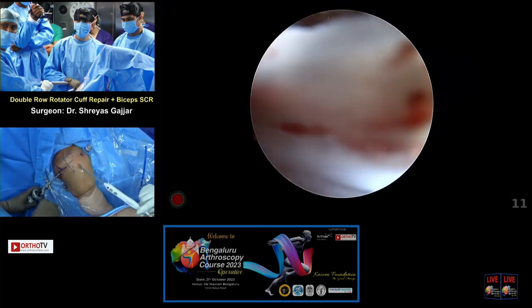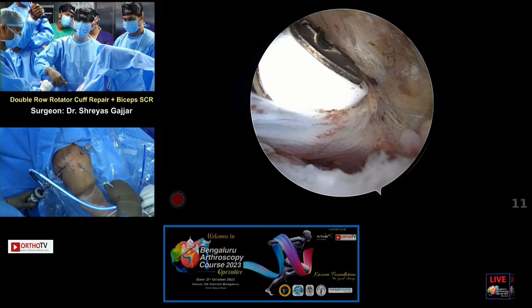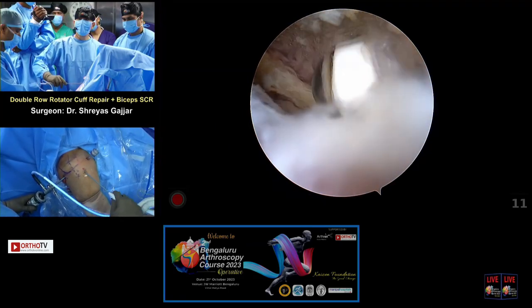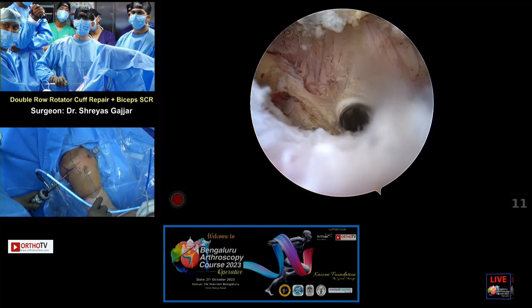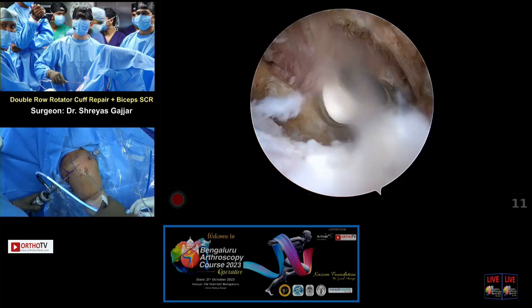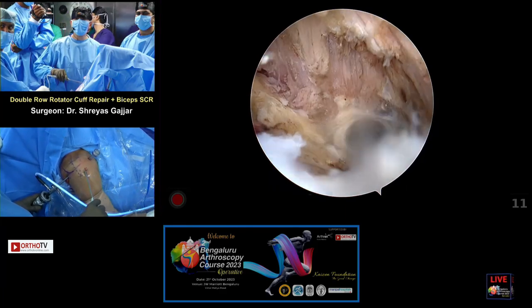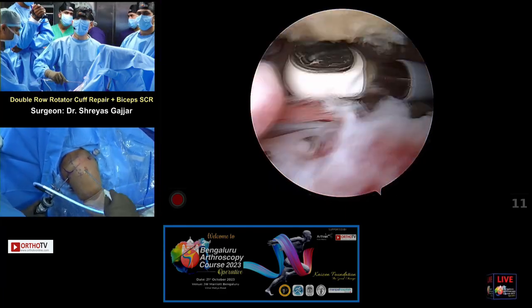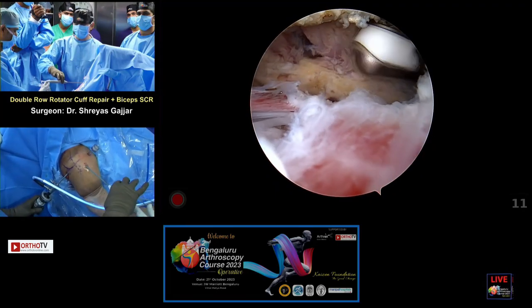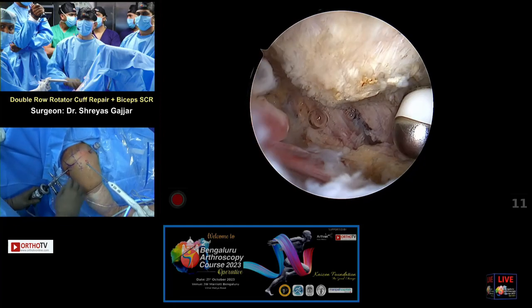So what are your landmarks inside the subacromial space to orient yourself? So the first thing I do when I enter is to see a white glistening surface superiorly. And that I know is the periosteum on the undersurface of the acromion. And obviously, when you insert the trocar, you want to have a feel that you are under the bone, so you don't go above it.